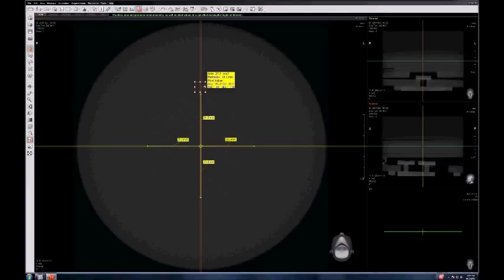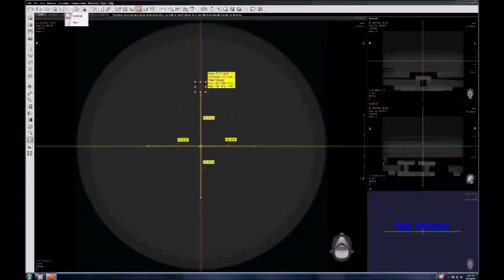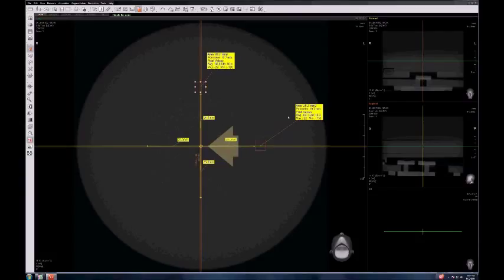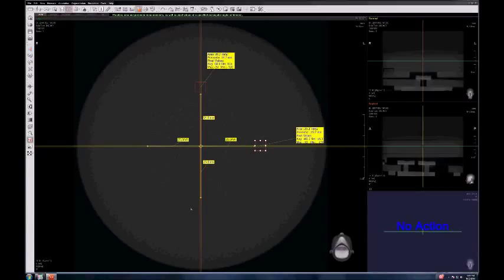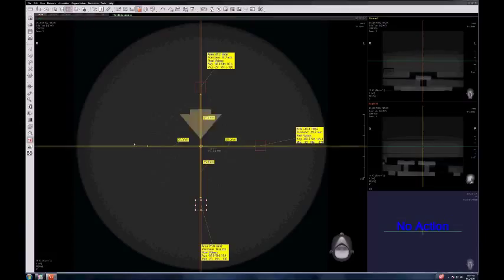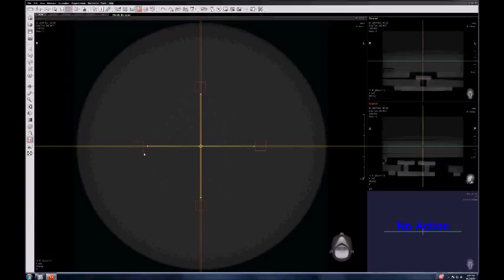Just try to place them in a nice spot so that you can see the labels and you know what label belongs to what region of interest. Try to draw those regions of interest so that they are about 25 millimeters square each. That is the area recommended by the manufacturer.